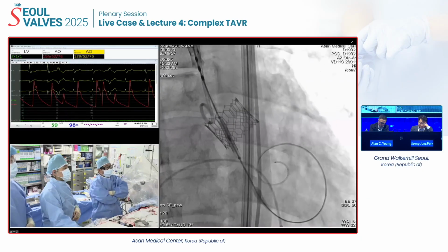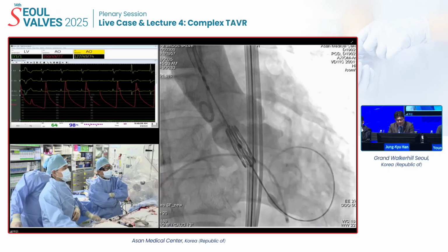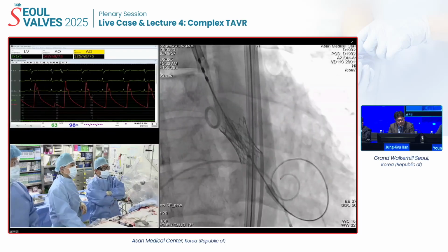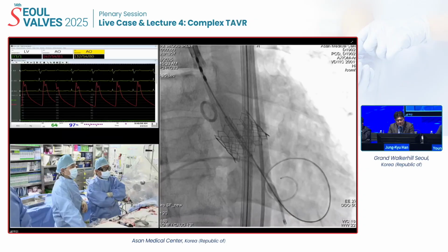I think it's because the conduction was not made one-to-one. So I would take a little bit of jumping. Yes. So push in, diastolic pressure is above 50, and push out, right? Okay, great. So this is sinus rhythm finally, so far.